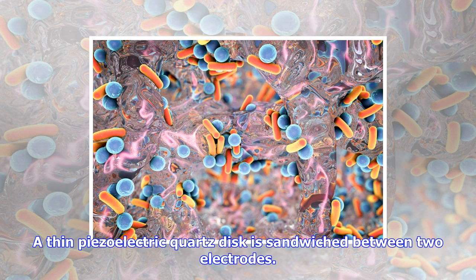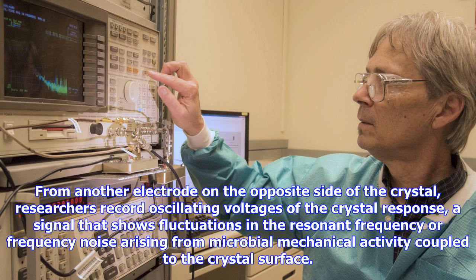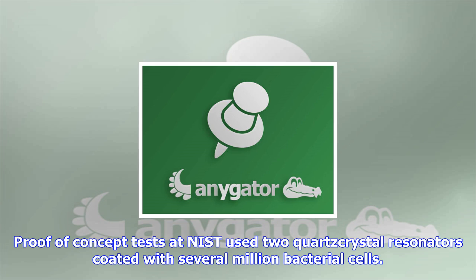Bacteria with paralyzed flagella were used in the experiments to eliminate effects of swimming motion. This enabled the researchers to conclude that the detected cell-generated frequency fluctuations arise from vibrations of cell walls. NIST researchers sensed the response of Escherichia coli (E. coli) to two antibiotics, polymyxin B (PMB) and ampicillin. Cell-generated frequency noise dropped close to zero within 7 minutes after the introduction of PMB. Frequency noise began decreasing within 15 minutes of adding ampicillin, and then dropped more rapidly as cells broke apart and died. These timescales reflect the normal speeds at which these antibiotics work.